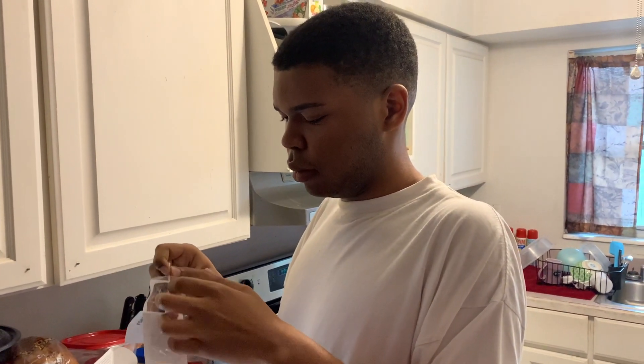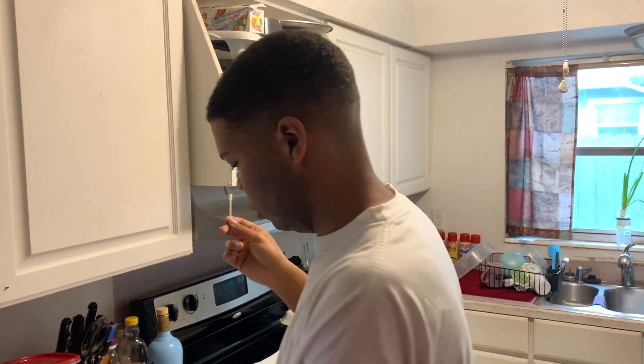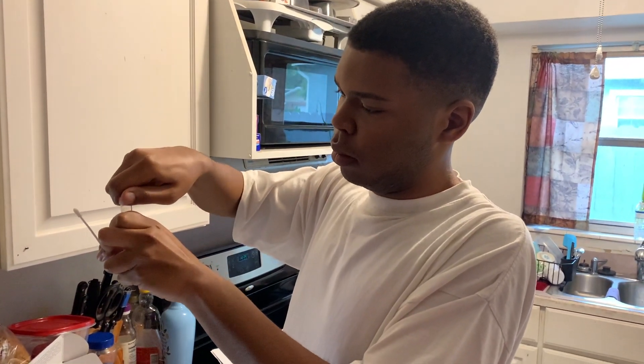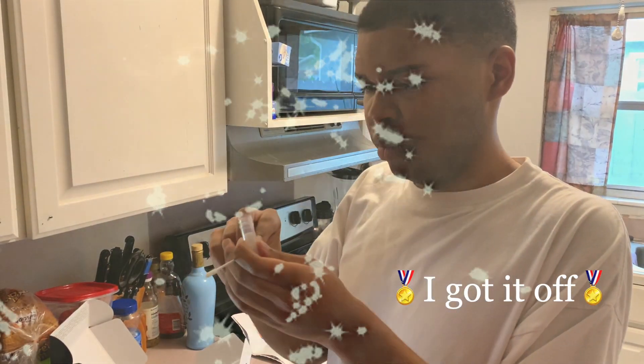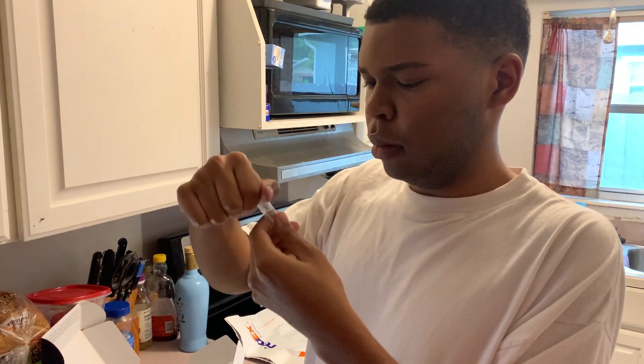Here is me doing my test in my kitchen with my dad filming. I had to put the Q-tip in one nostril, swirl it around three times, and then put it in my other nostril and swirl it around three times as well. Then I had to put it in this test tube they gave us with some liquid so it would preserve the germs, but I could not get the thing open for the life of me. I put it in there, put the top back on, and we're all done.